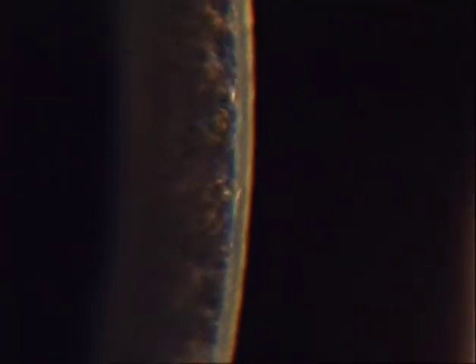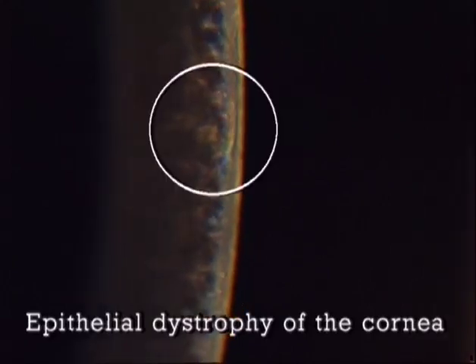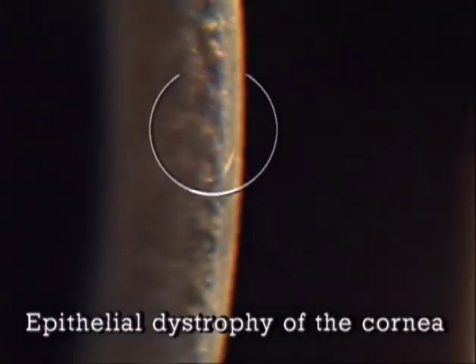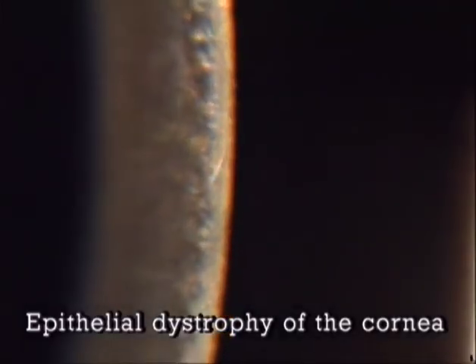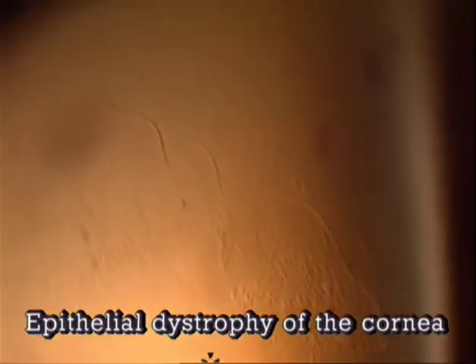This technique allows the visualization of alterations which are hardly visible by other techniques of illumination. An example is this epithelial dystrophy of the cornea. The epithelium is a layer too thin for tiny phenomena of scattered light to be easily detected. However, by observing refraction phenomena against the yellow backlight from the iris, the very fine changes in the epithelium are easily recognized by distinct dark lines and outlines.